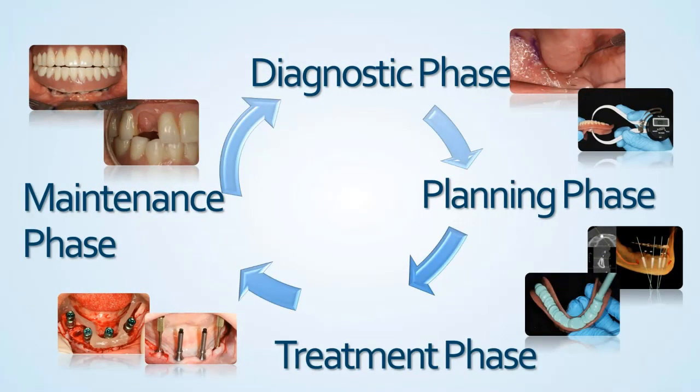We see our patients throughout their life history. Now, sometimes we get the patient all the way through the treatment phase into the maintenance phase, and they might re-enter the diagnostic phase, having to add additional implants, maybe to convert from a fixed to an overdenture or from an overdenture to a fixed prosthesis.